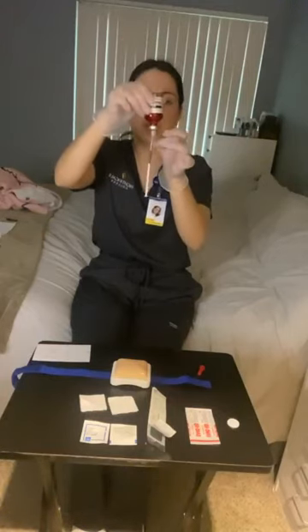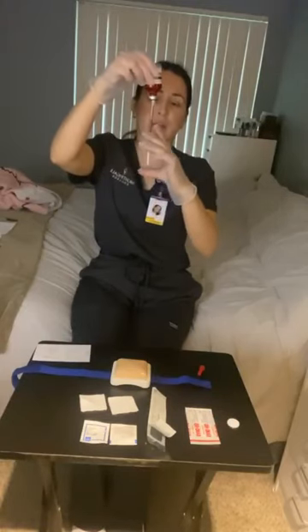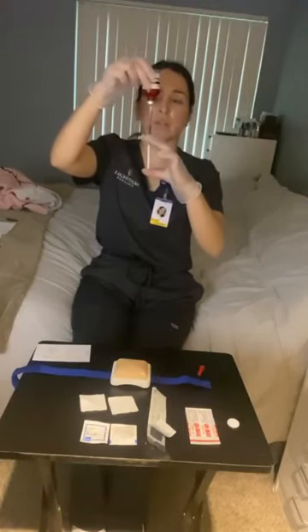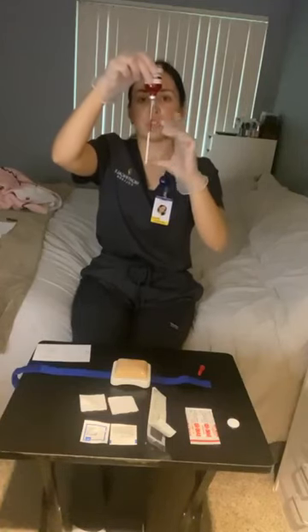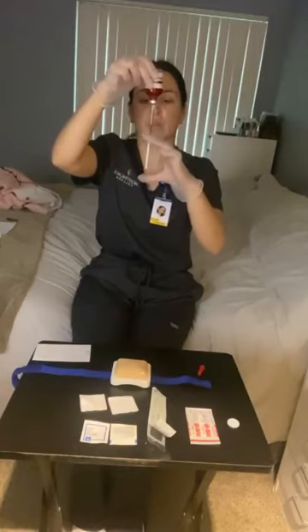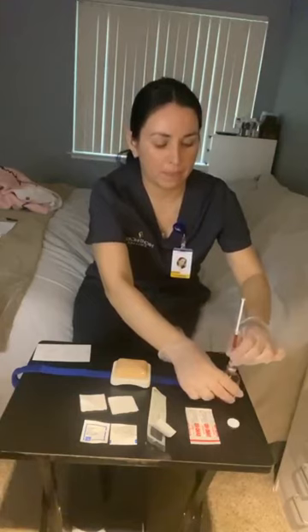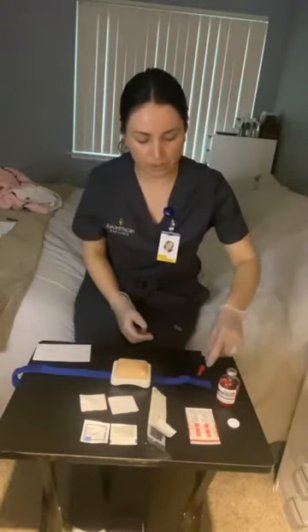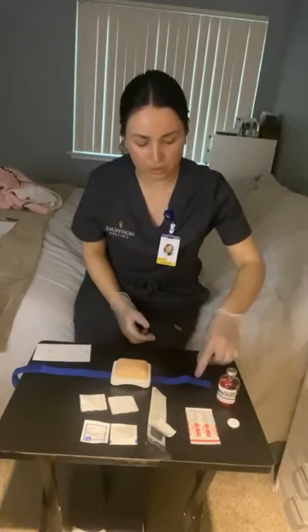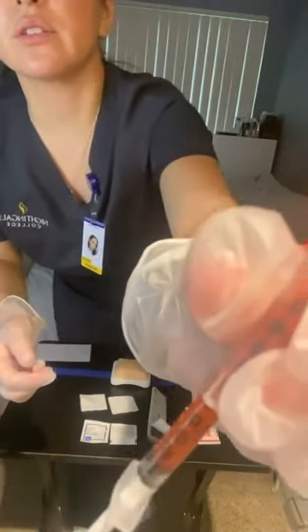At this point, I'm going to tap to release any air bubbles and then gently push back the air into the medication vial. If there's still air bubbles, I would inject the air again and make sure I get my correct dose. I'm going to keep the needle clean and use the 1 scoop method. And I do want to show you guys, I have 1 milliliter in here.